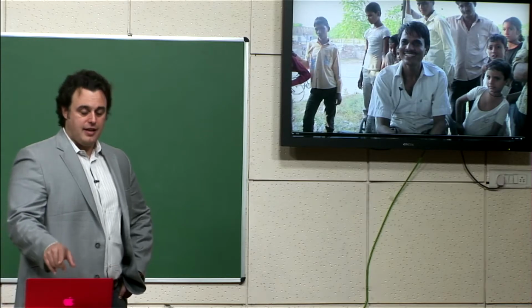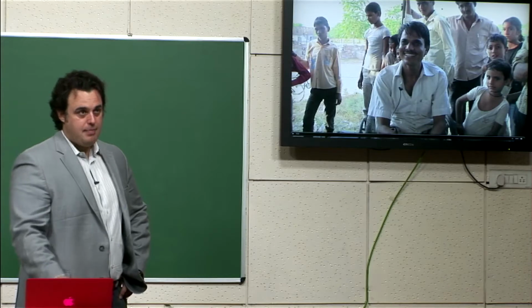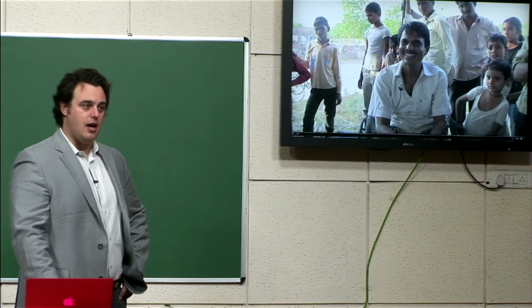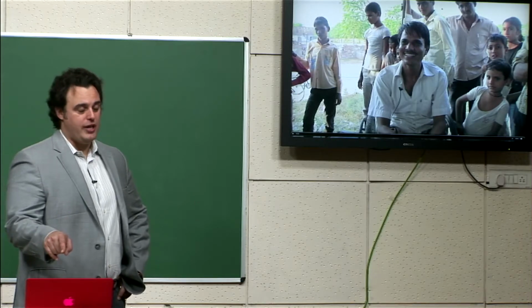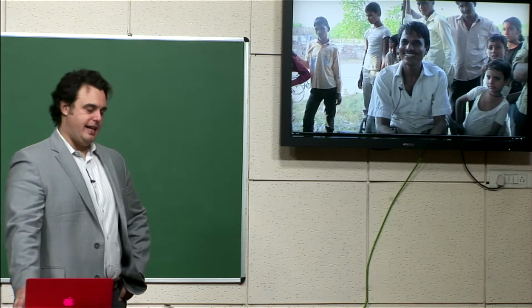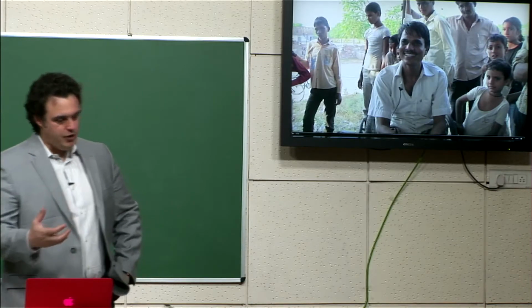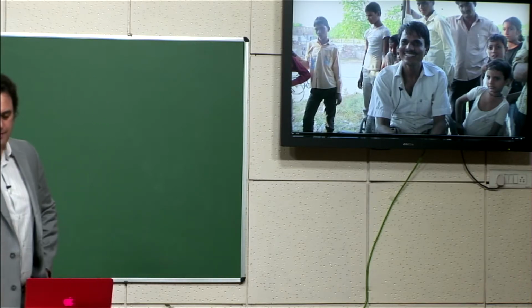But with the LFC, those 10 people averaged independent travel of 2.7 kilometers per day, and 4 of those people were able to get employed again, like this guy Ashok. So those were compelling data for us, that we had something of value here, that people liked, they were utilizing it, they were excited about it, and that it could actually benefit their lives.